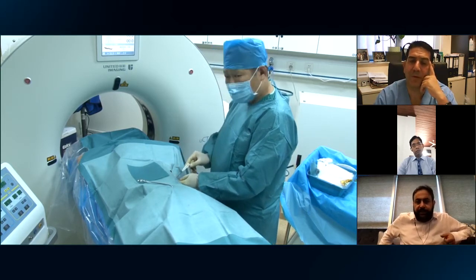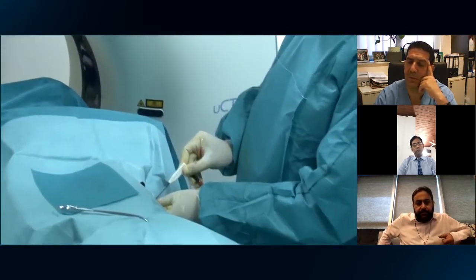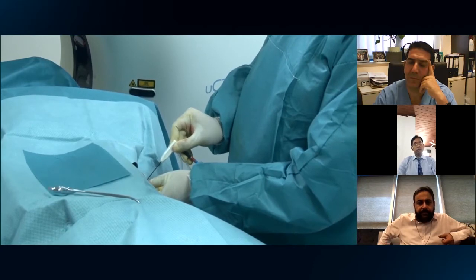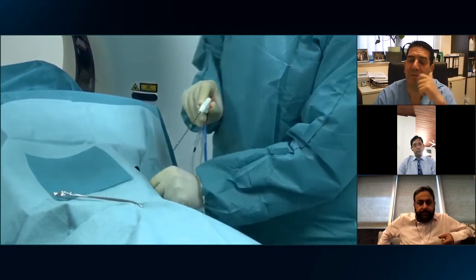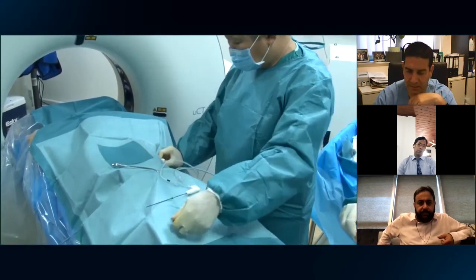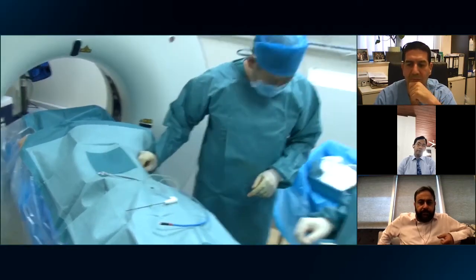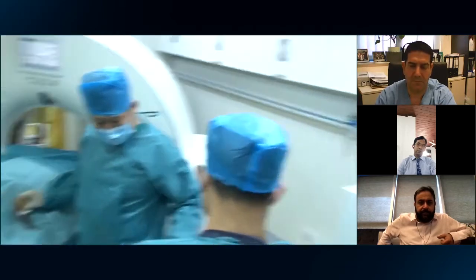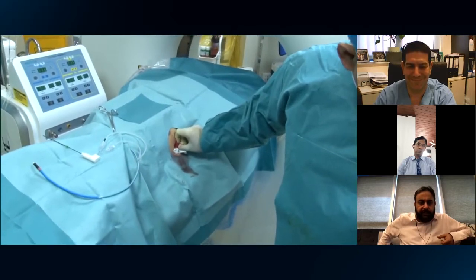So basically, will the professor do a track ablation in the end, or no? Track ablation. Yes, track ablation. Okay, he withdraws the antenna.